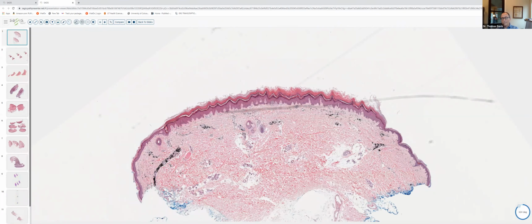Some of them are quite chunky. And then we've looked at gel foam, which is characterized by these irregular arabesque-shaped kind of blue-purple structures that form like a net-like pattern and are surrounded by granulomatous inflammation. And again, I would be familiar with this because you're likely to be testing on materials that you're going to be implanting into the skin.